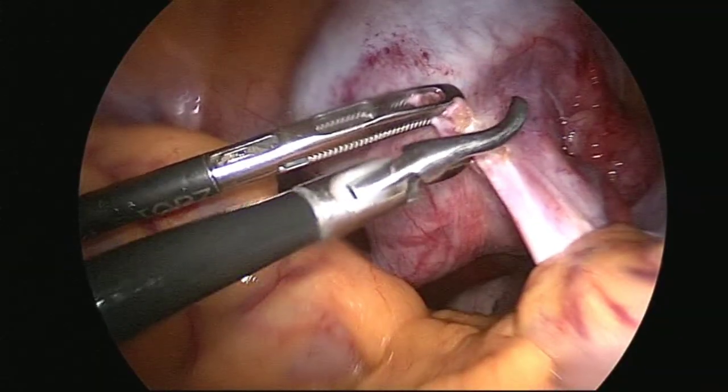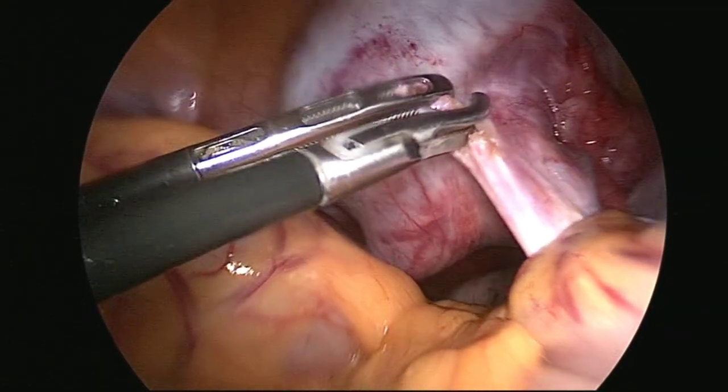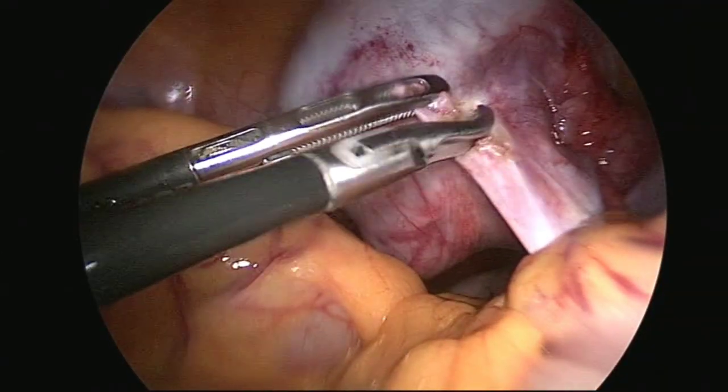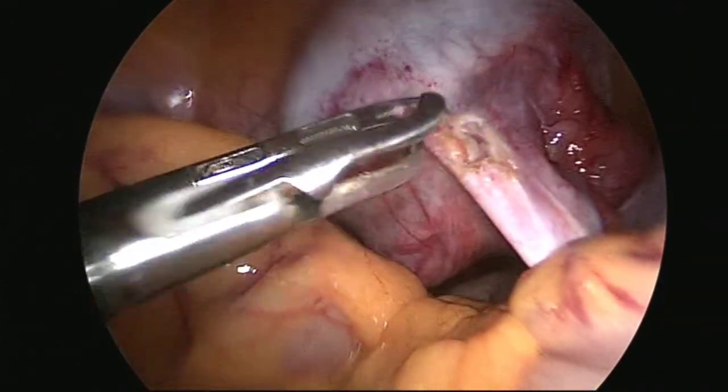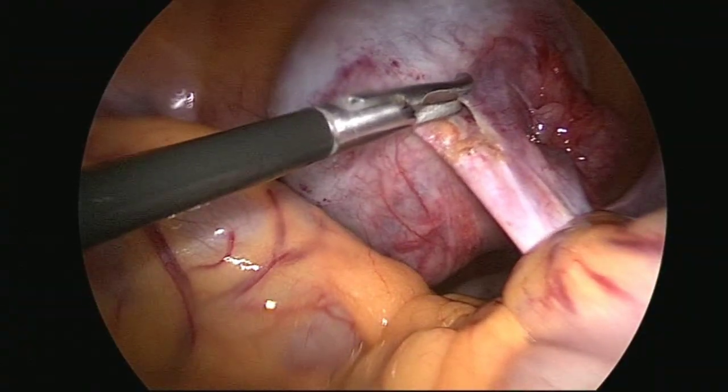Once I create the plane, then it will be very easy for me to enucleate the cyst. Hopefully this is a good plane.